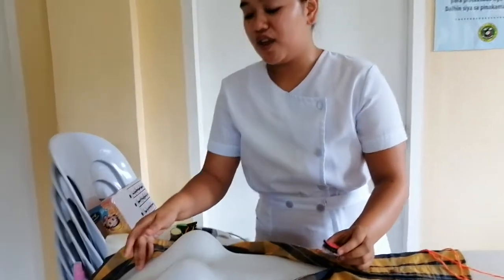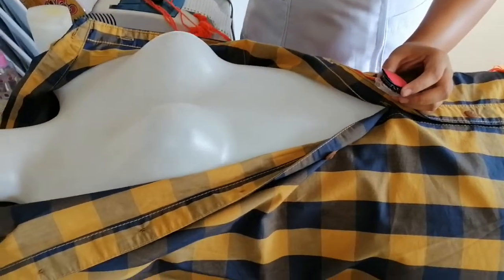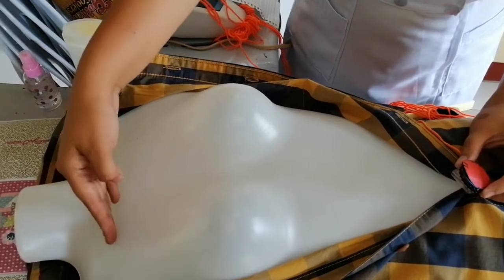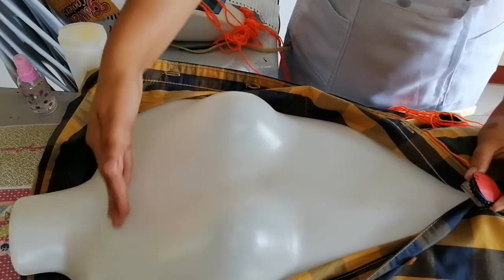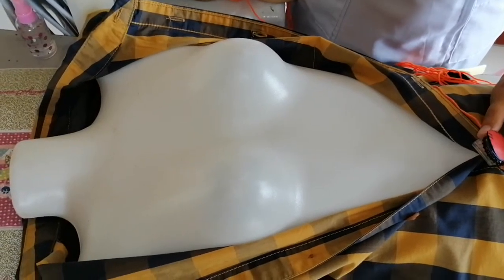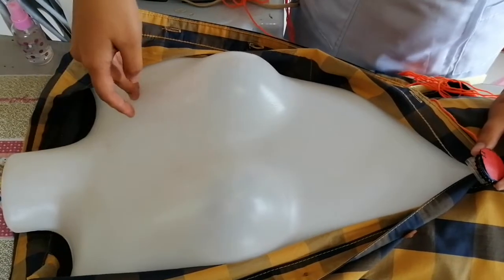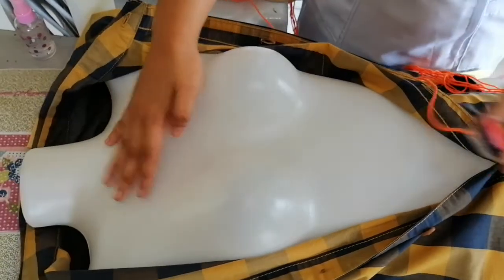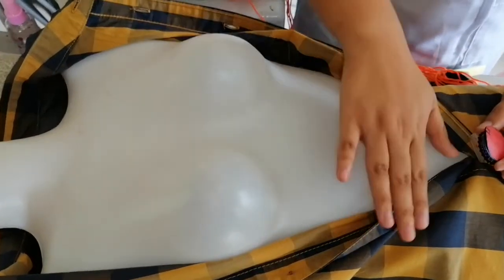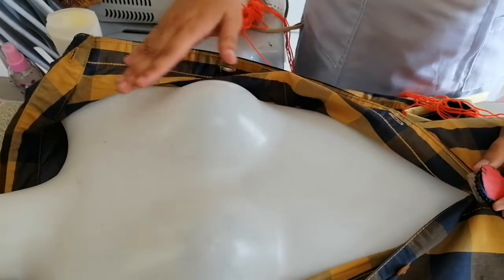It is important to take note that in the sternum part or the chest part of the body of the clients, we have very important landmarks. What we call the clavicle or the sternum. The prominent bone that we see in the chest part of the clients. So the V1 will be placed on the right part of the chest and to be located at the fourth intercostal space.